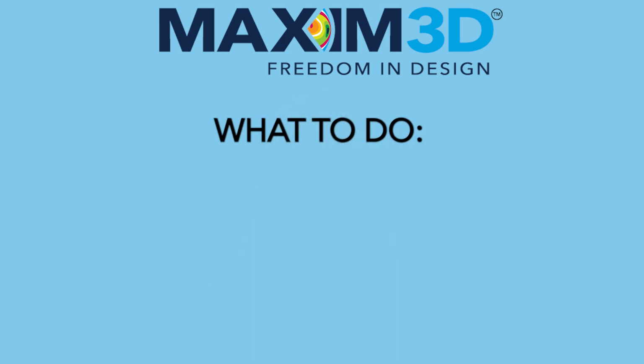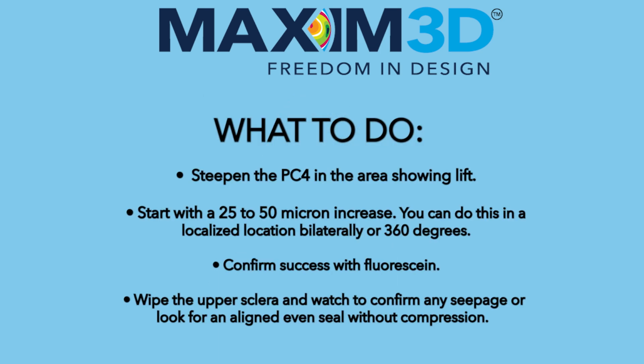Here are options to correct. Steepen PC4 in the area showing lift. Start with a 25 to 50 micron increase. You can do this in a localized location, bilaterally, or 360 degrees. Confirm success with fluorescein. Wipe the upper sclera and watch to confirm any seepage, or look for an aligned, even seal without compression.